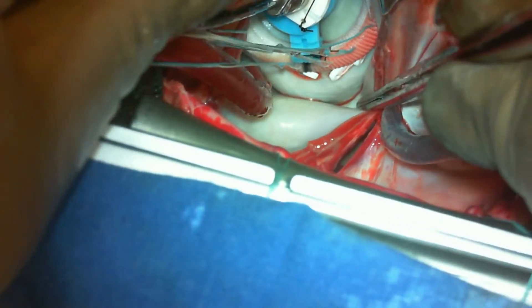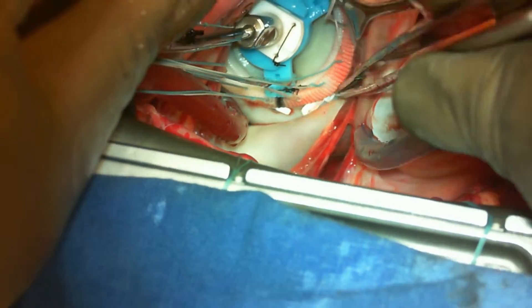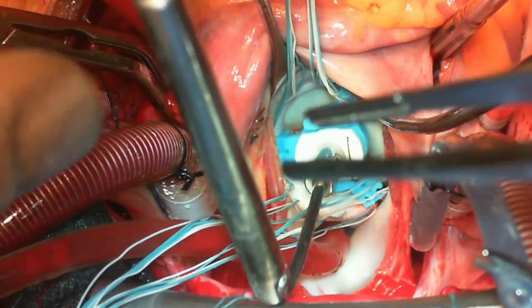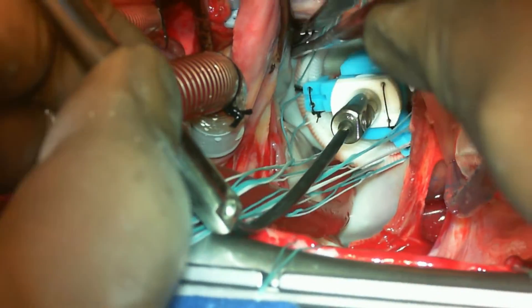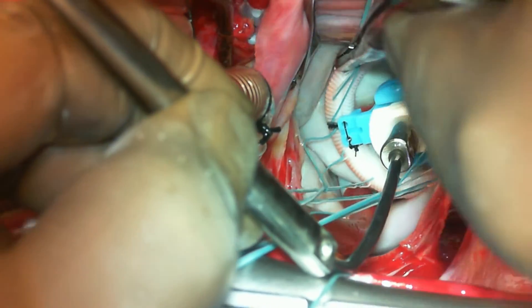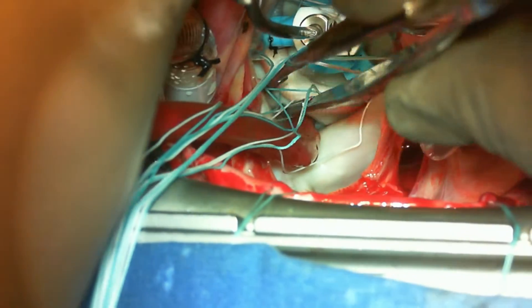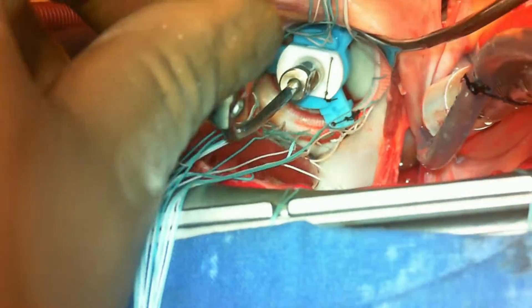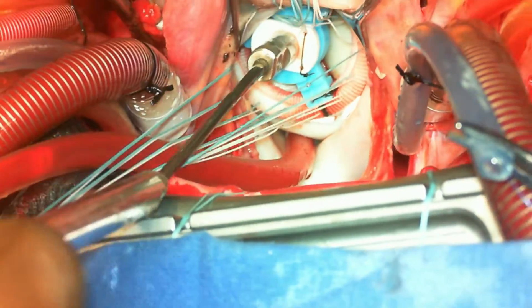As mentioned before, all the pledgets have to be seen before tying whilst the valve is seated onto the mitral annulus. As you can see here, taking a bit of time to check whether the pledgets are visible or not. You can pull the sutures and check — the posterior pledgets are seen here. You have to check for the anterior, lateral, and medial pledgets as well, and then tie the sutures.